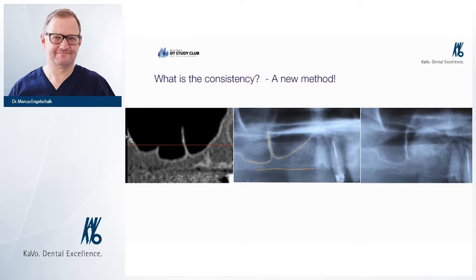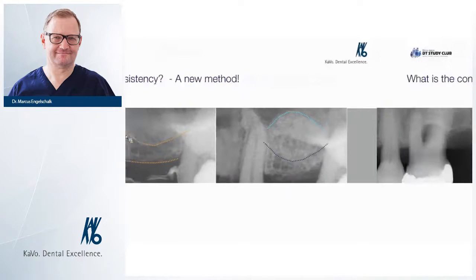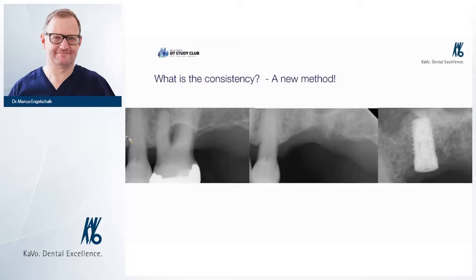We're using now a new method. If you look at this case, it's cone beam picture 2. You see this is the molar side. We have enough residual bone, but we need something more to put the implant in. Then it's very easy. Just drill your hole, your chamber into the bone until around 1.5 millimeters underneath the bone. Just stop, because you're creating a chamber. And if we're talking about placing an implant at the same time as the sinus floor elevation, then you're creating this chamber at the position of the planned implant.